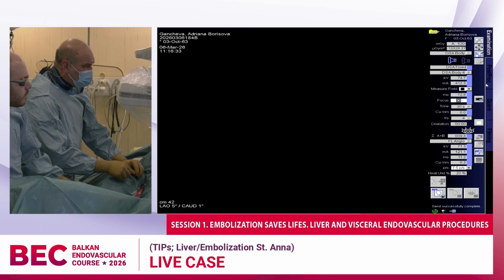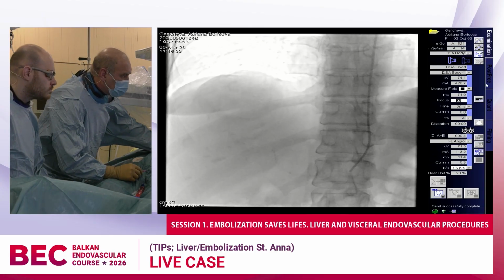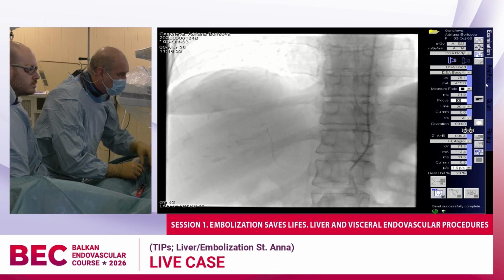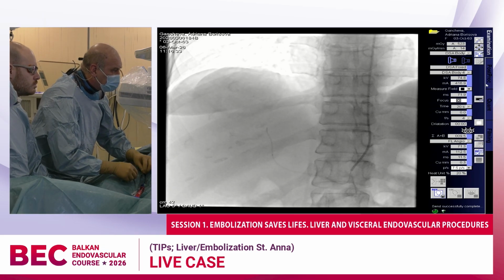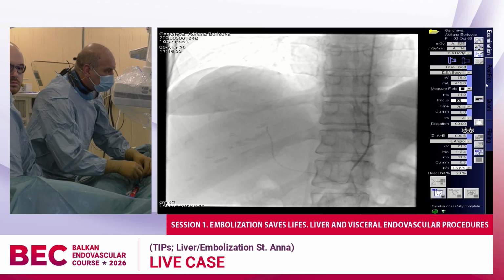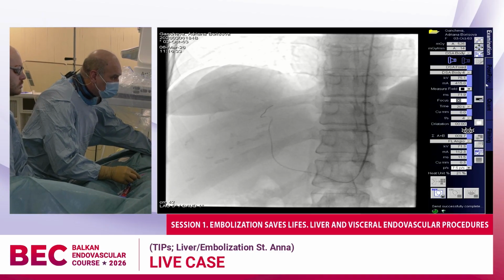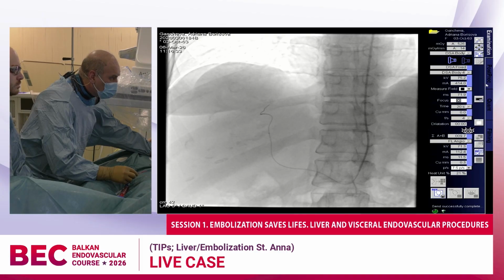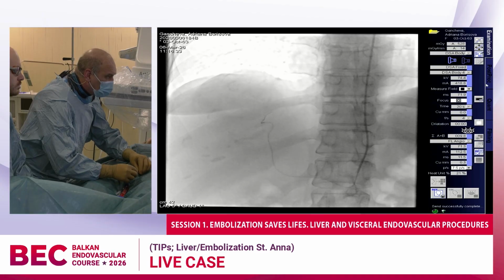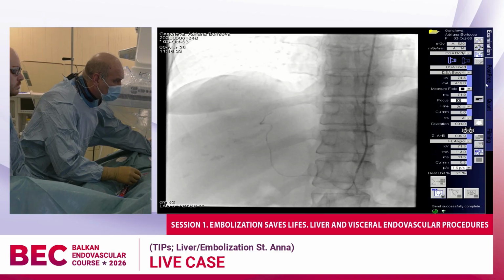Sometimes when the patient is taking a deep breath, you may inadvertently pull the microcatheter back, like in this case. We want to be selective, so we will go back. That looks good now. Yeah, so it is not always easy to take the final turn.